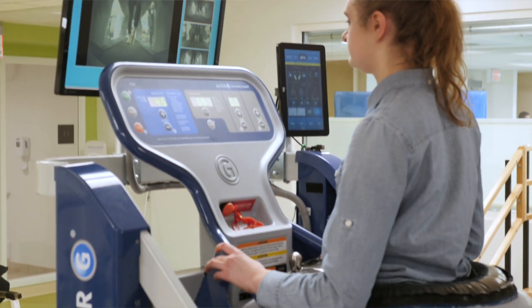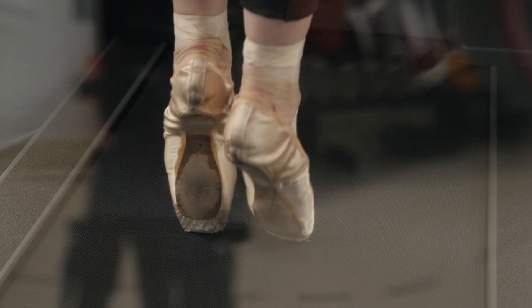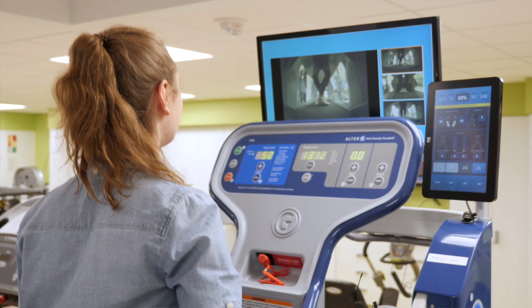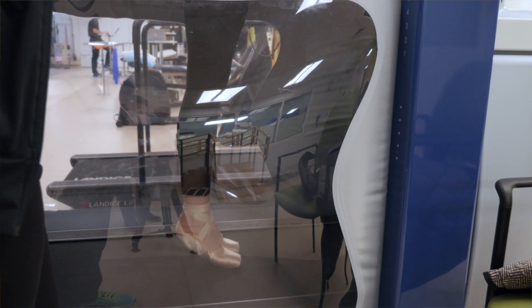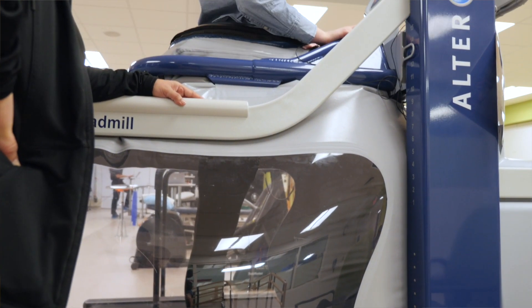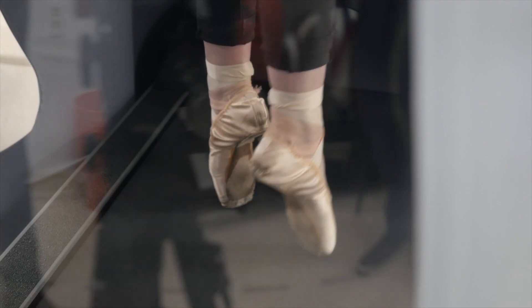I had a surgery at the beginning of the summer to release a nerve near the ball of my foot near the toes, because I was having a lot of pain while dancing — especially on pointe. So I came here to Mary Free Bed with Christy to do physical therapy and make my foot stronger, and I'm going to have another surgery in the beginning of December. I'm able to do a lot of the things I can't do on land right now — still gain and maintain strength while not being at 100% of my body weight. Each time, the weight we're at increases, so as I get closer to 100% I'm able to do more.